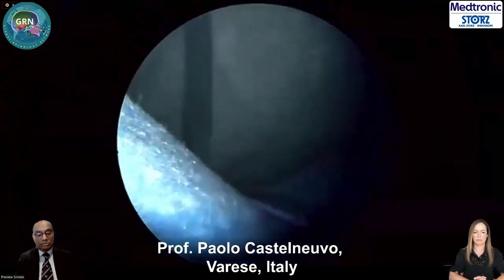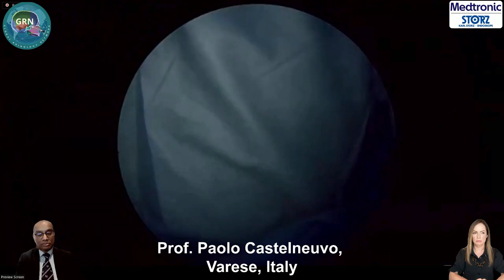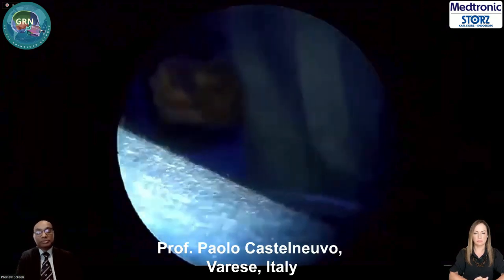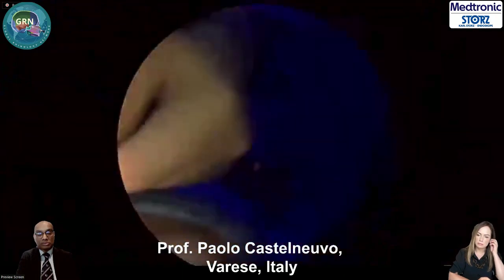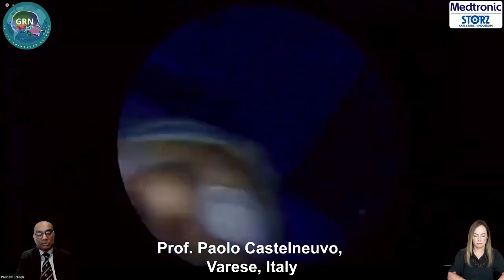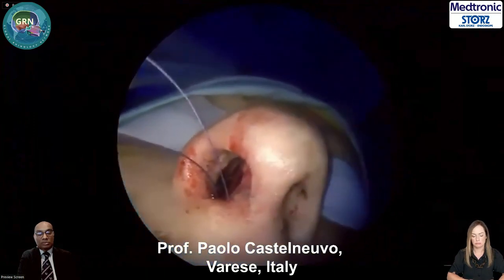Now I have to fix the cartilage to the anterior spine, the septoplasty part of the operation, because yes, I did a septoplasty because there is an anterior deviation, and I like to fix the anterior edge.